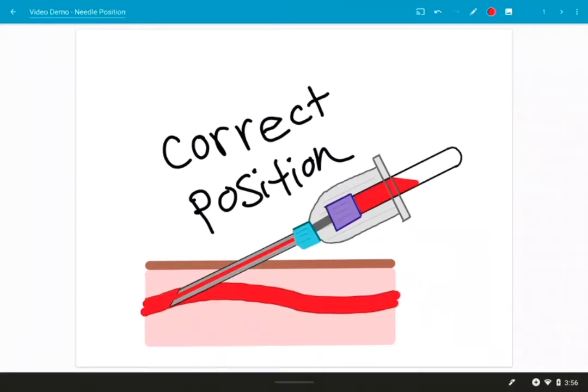Hey all, this is going to be a quick review video on how to position your needle when you are going into a vein.